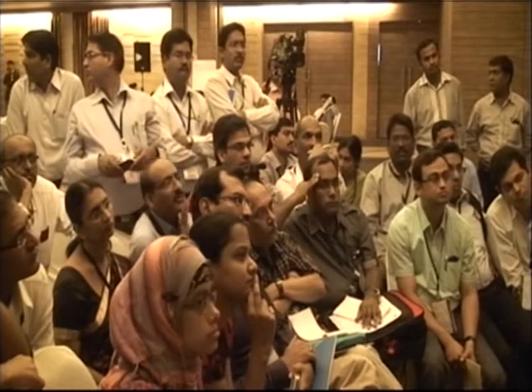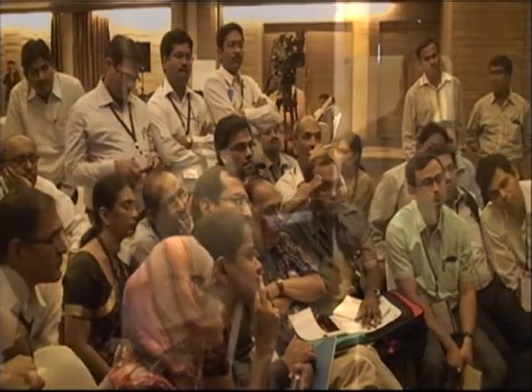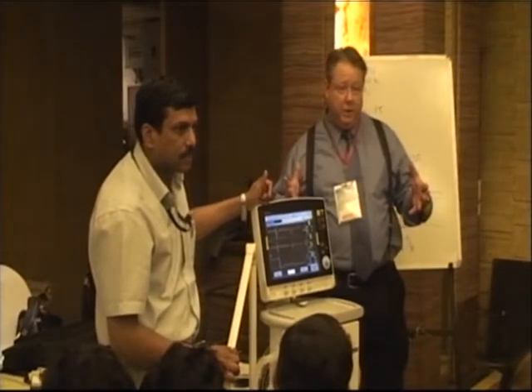Do people understand that concept? You have to look at the graphics. That's why you really can't do this mode without this kind of ventilator, with the graphics package. Without it, you really are flying blind. You don't really know what you're giving.